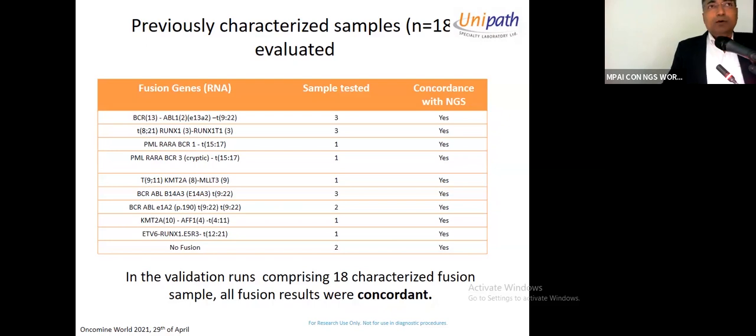But always this has to be seen in the context of history. I got a sample, I was getting 50 reads, an 821 positive sample. I reported it as negative. It came back, this is a post-treatment sample of 821. Now, this history is not available, I'm not able to figure out correctly, and I'm removing that from my algorithm.